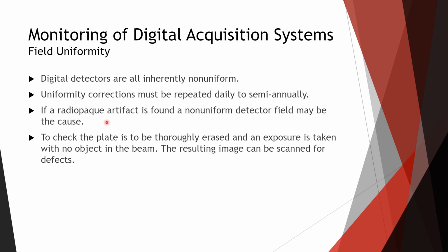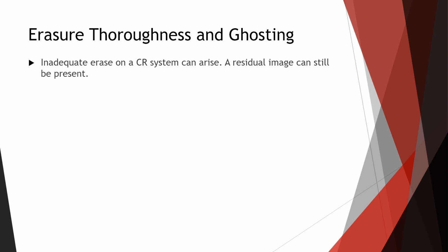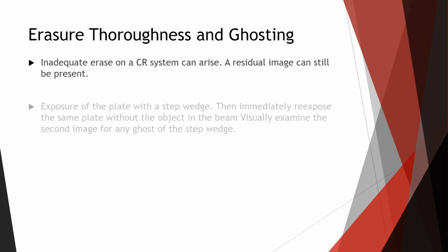This really applies more to DR. This applies more to CR, but there's interchangeability. Erasure, thoroughness, and ghosting. So we just kind of talked about this. Inadequate erasure of a CR system can arise. A residual image will still be present.